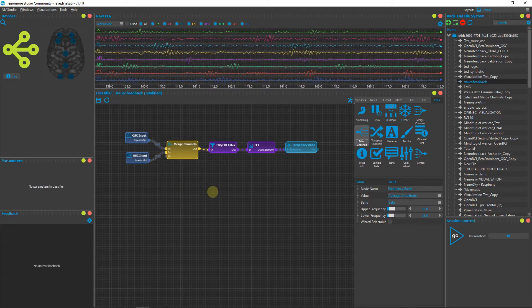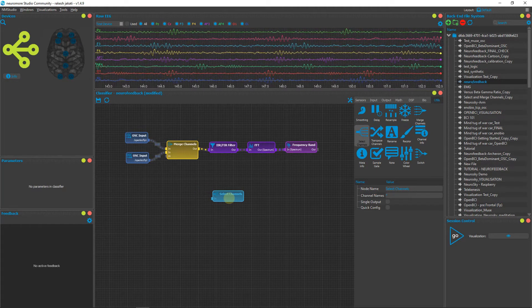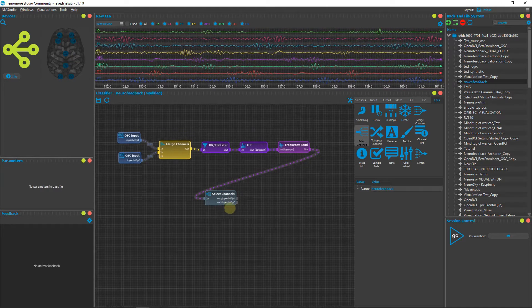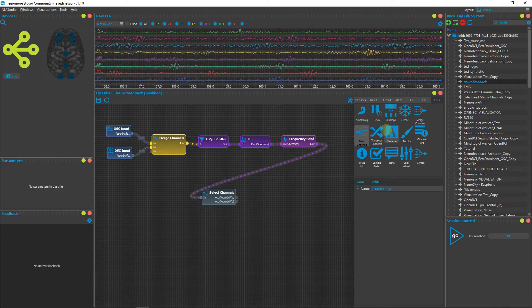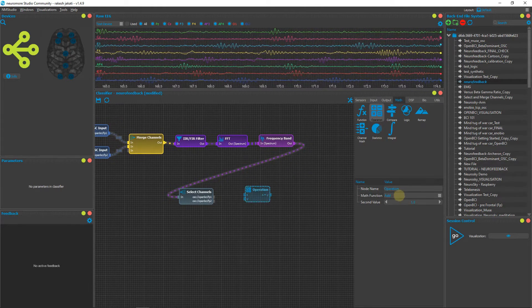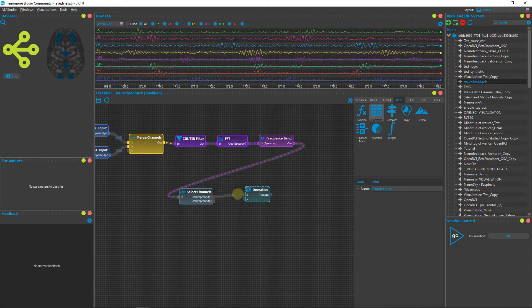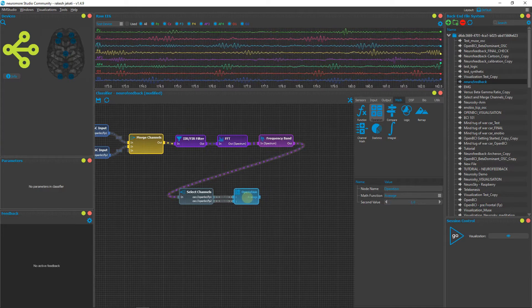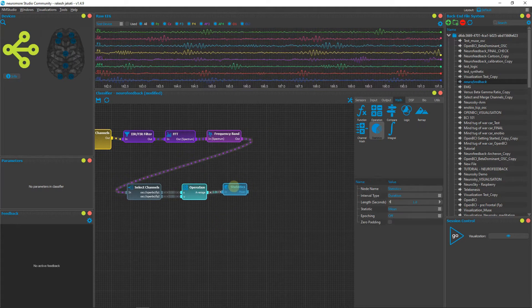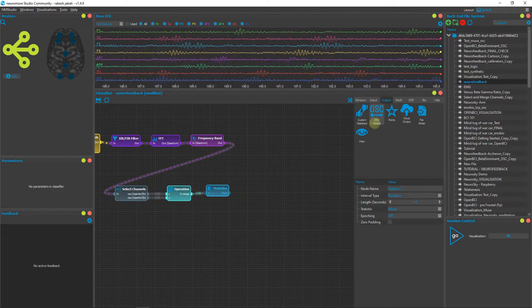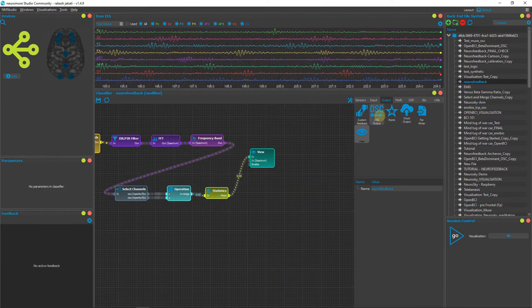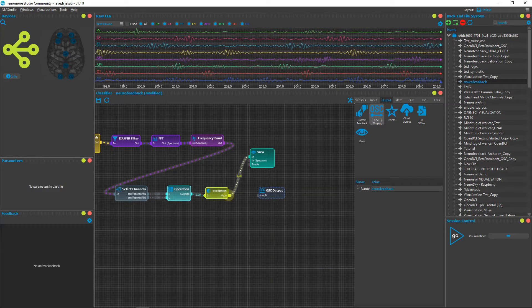Next, go to the Utils tab and select Channels. We need to perform operations on both channels, FP1 and FP2, so we select them individually. Connect the output of Frequency Band to Select Channels — you can now see FP1 and FP2 listed. Now we need to compute the average of both channels: select Operation, change the math function to Average, and connect the two channels to X and Y. Then connect the Statistics node to smooth the output. To view the signals, go to Output, drag a View node, and connect Statistics to its input.